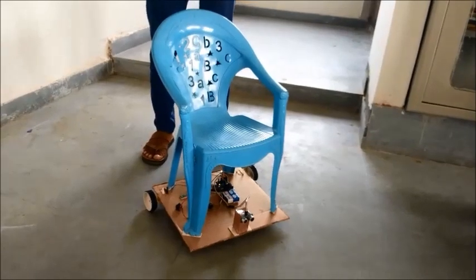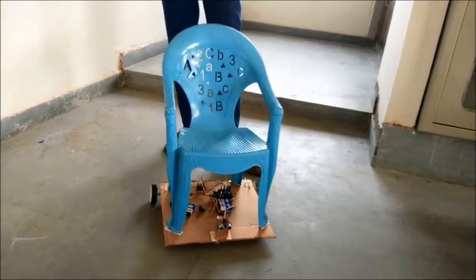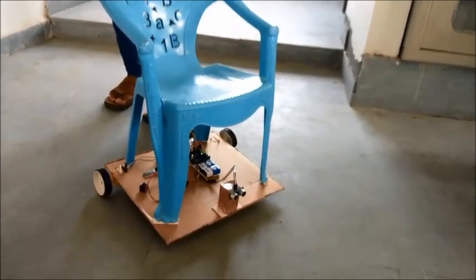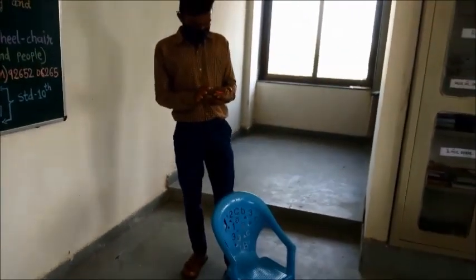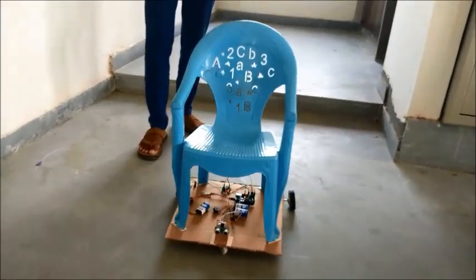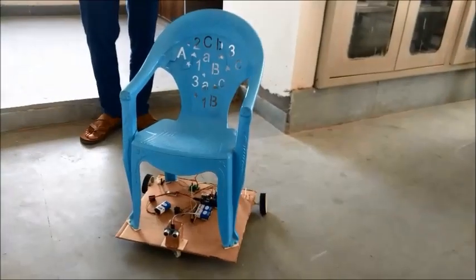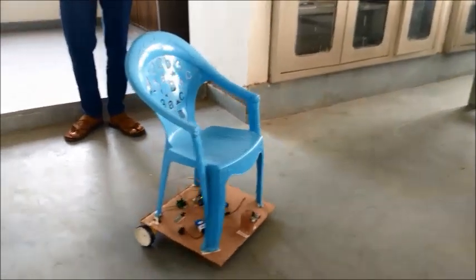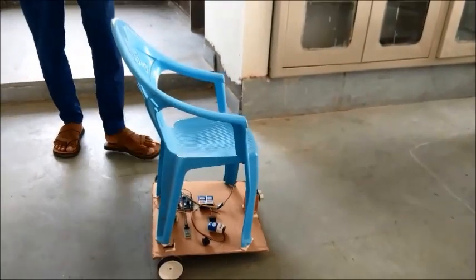Right. Forward. Now we will see the left and backward commands also. Backward. Stop. Left. Stop. This is the actual working of this process.